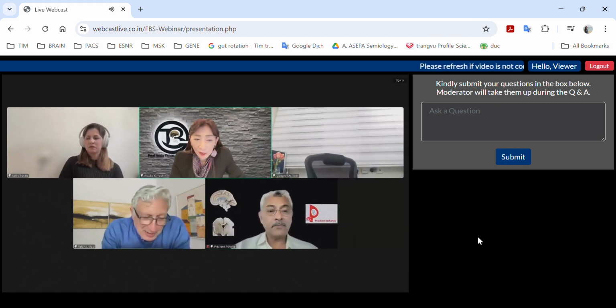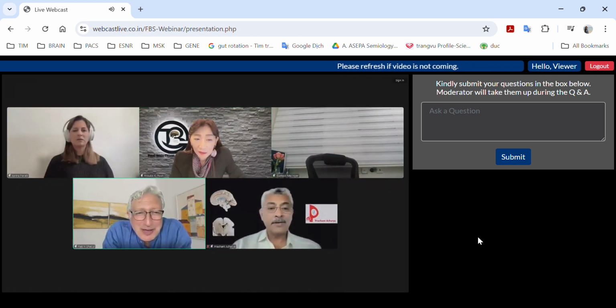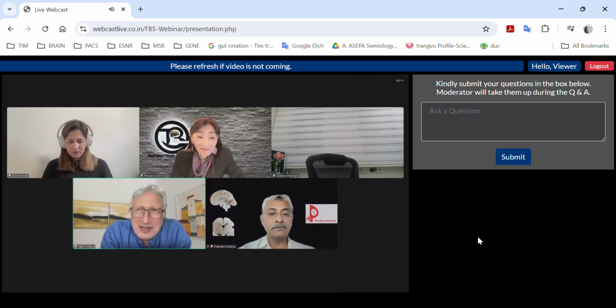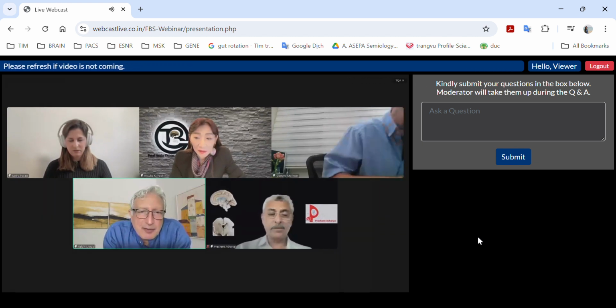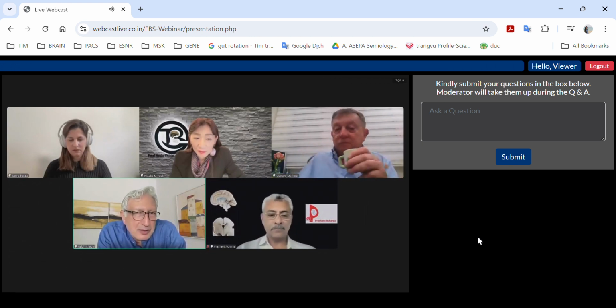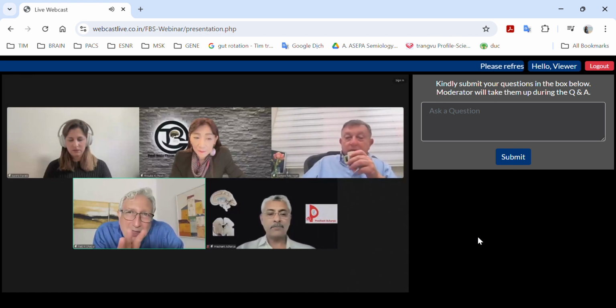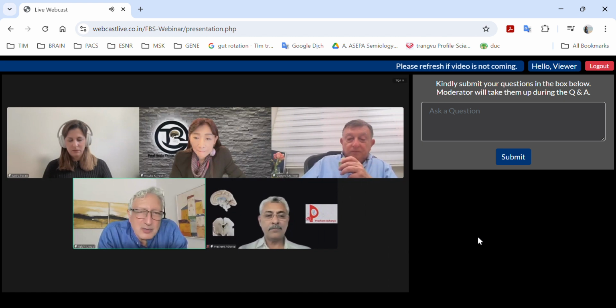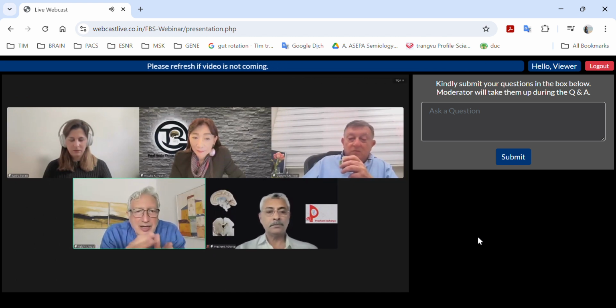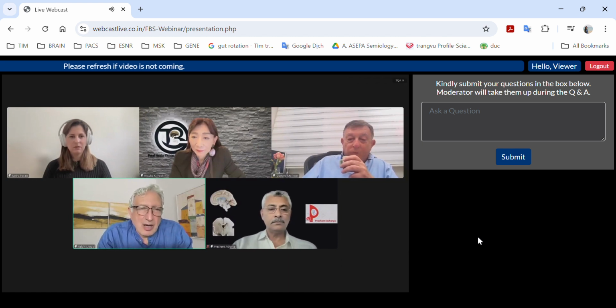Yeah, so I learned from Mitsuko, if I'm scanning transvaginally today, tomorrow, I'm always acquiring volumes, because especially if you want to compare left-right, you may be very oblique if you are looking at 2D. If you think one hemisphere is larger than the other, and you have a standardized approach, you don't need to scan longer. You can have several volumes. Later on, you can have a look here and there. And this is what I changed today in my daily work.